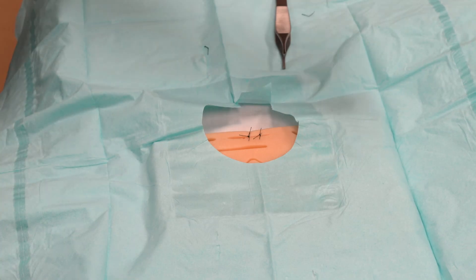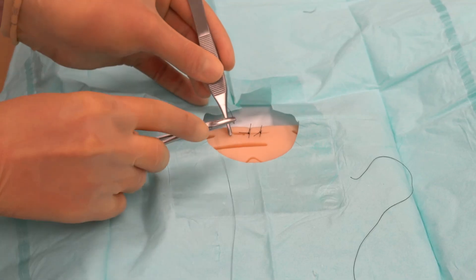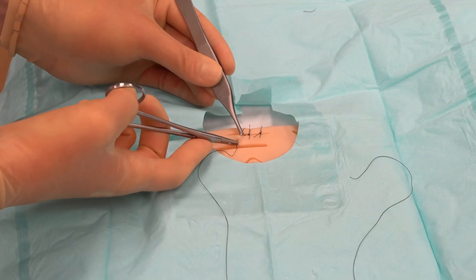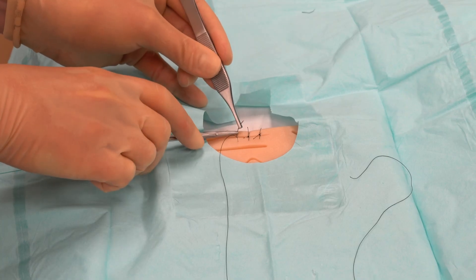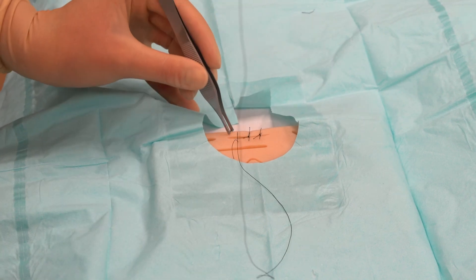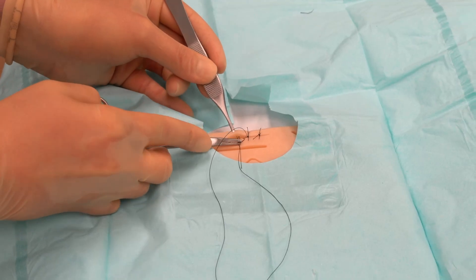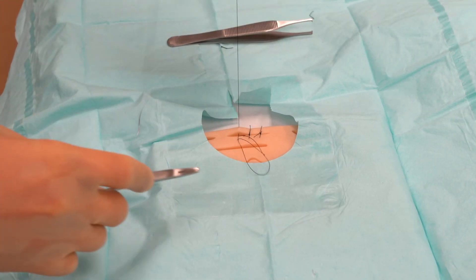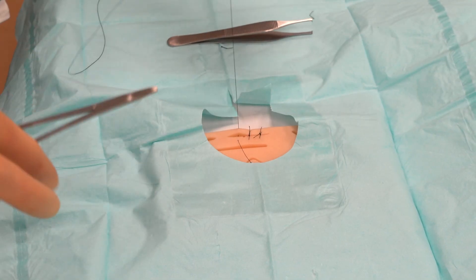I'll do this one more time, the fastest one. Re-pick up the forceps, grab the skin edge at a 90-degree angle, directly down to the floor, twist your wrist, and pull the needle through. Grab the left edge of the wound, needle into the center, twist your wrist, pull the needle through leaving behind a short tail, and complete the instrument tie.